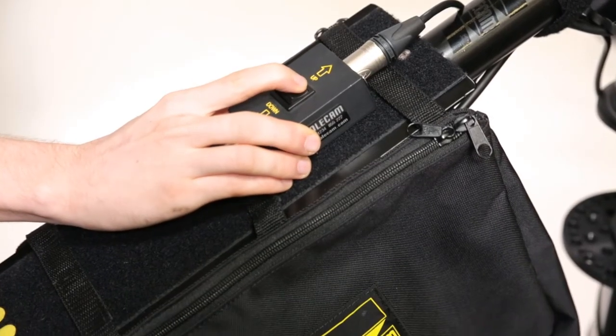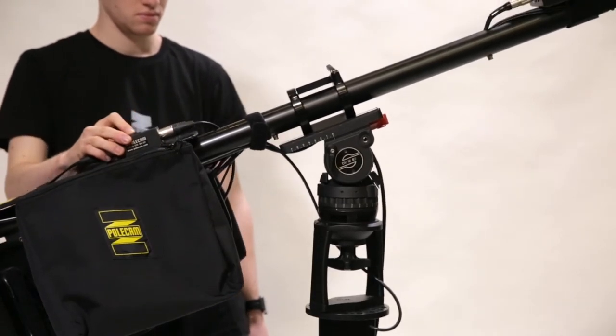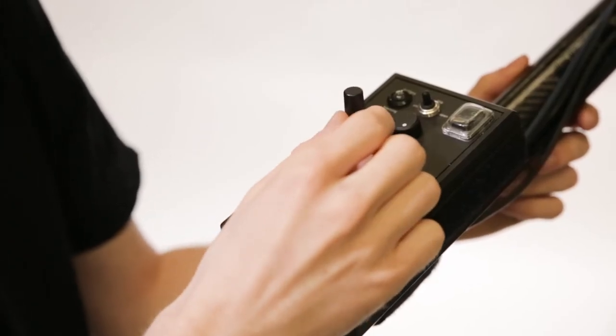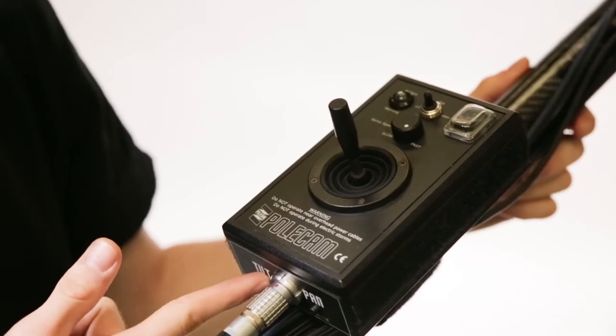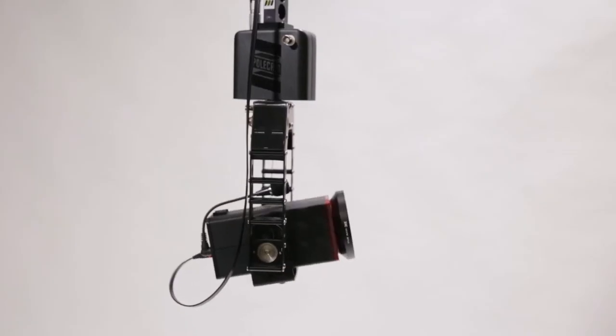You can also raise and lower the pole cam using the autopod controller. The joystick will give you full pan and tilt control over the head, and the direction of this can be reversed using the dip switches at the base of the unit.